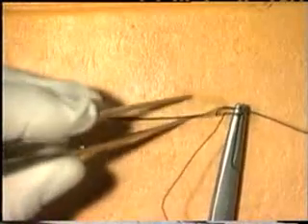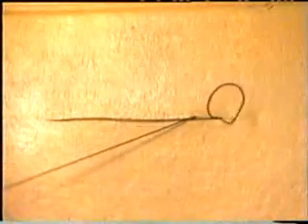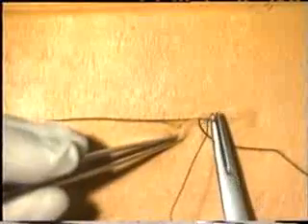Each new suture must be inserted almost opposite the exit of the previous suture, and this ensures that as the suture material is tightened, it draws the wound edges together, almost in the manner of invisible mending. The accuracy of the placement of the sutures will ensure an equal tension down the wound and neatness of the closure.